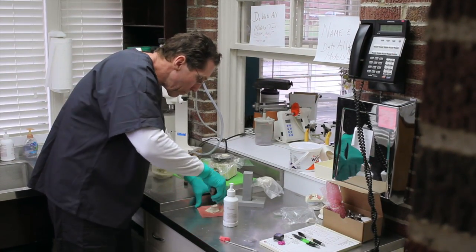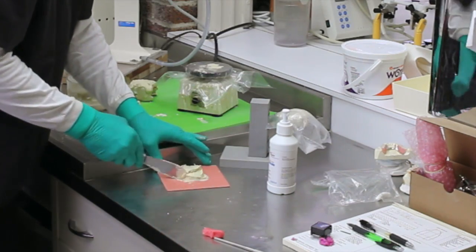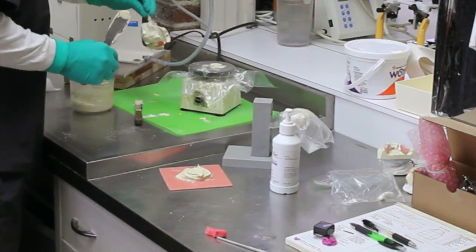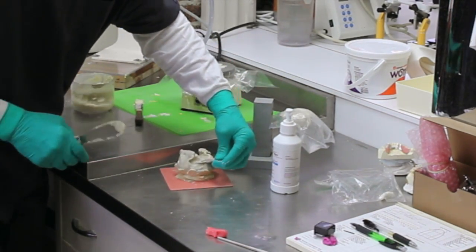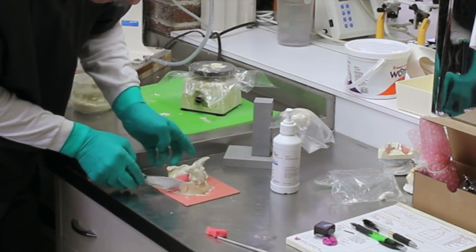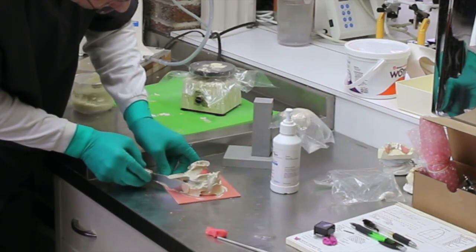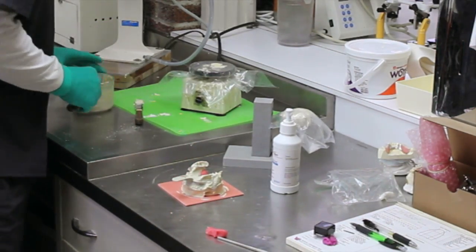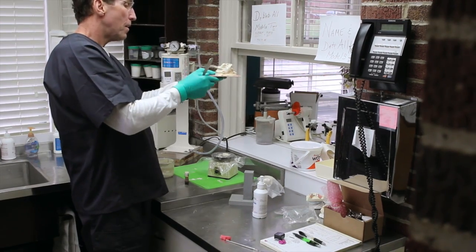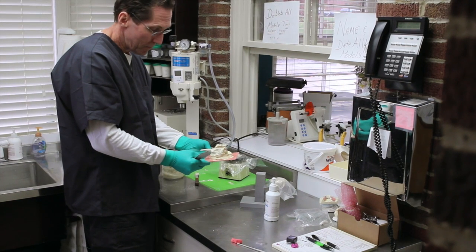And we'll form a little bit of a base here. And we will invert the impression on that. Neaten that up a little bit. And there we have it, and there we'll let it set. And we'll take a look at that after it sets.